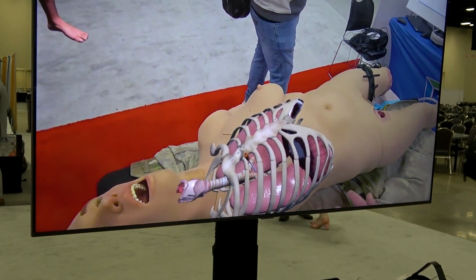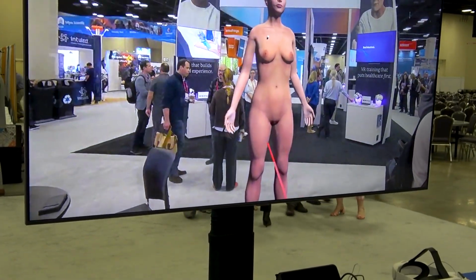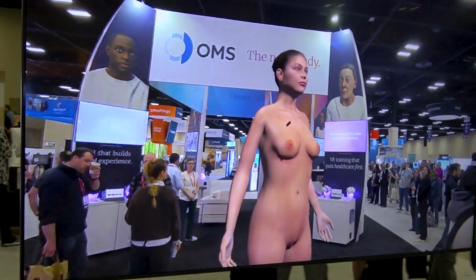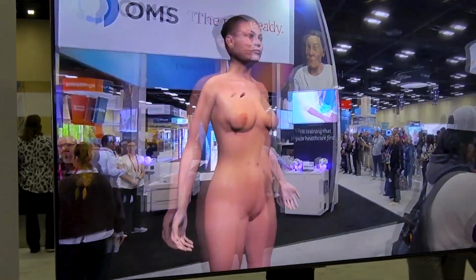So you can now see that both sides are moving. See that also on my 3D character. You also see that needle D in place there. So we can also do some instruction.